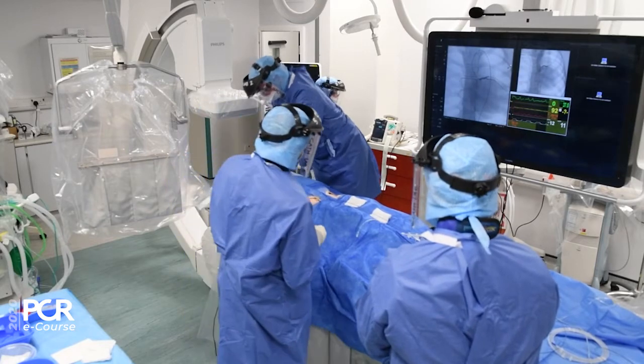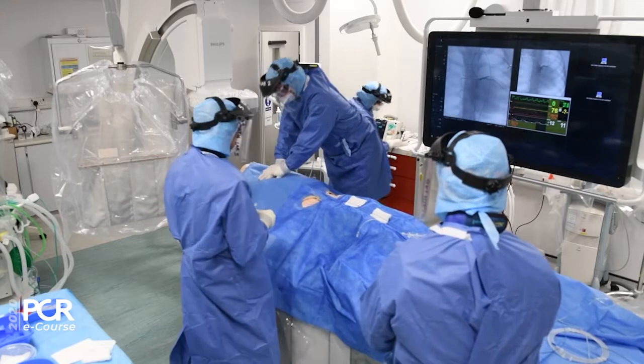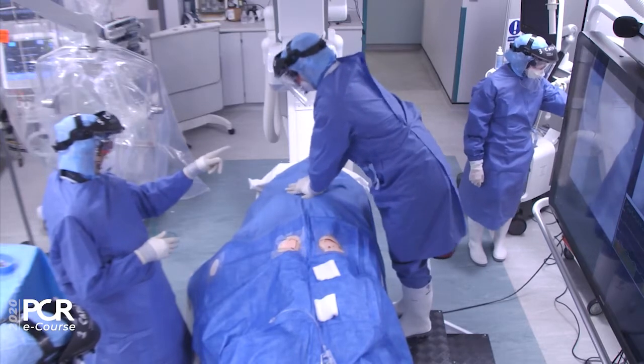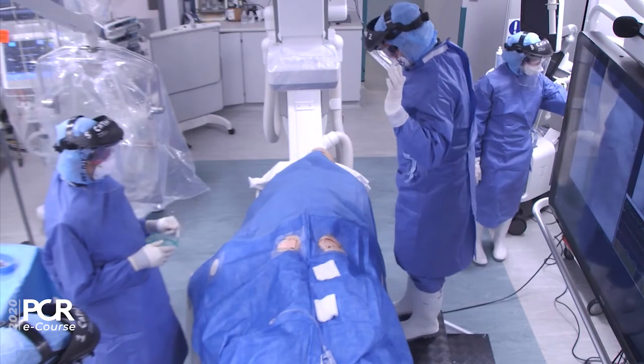Okay, 2 minutes, we'll check the rhythm. 2 minutes over. Let's check the rhythm. It's still VF. Okay, shock again. Charging. Don't shock yet. Tell me when you're ready. Yep, ready. Ready, clear. Stop CPR.